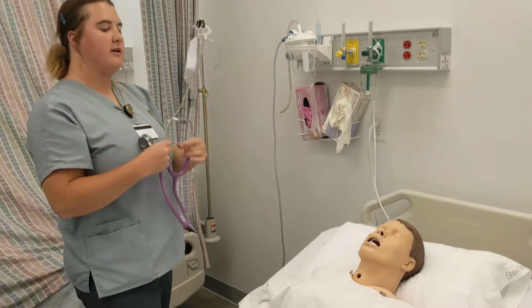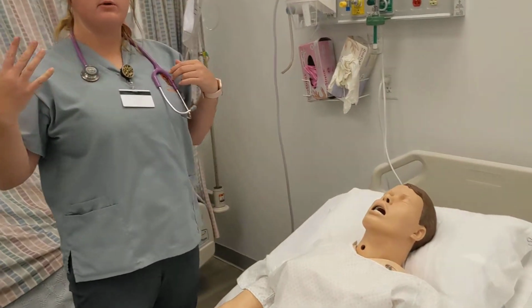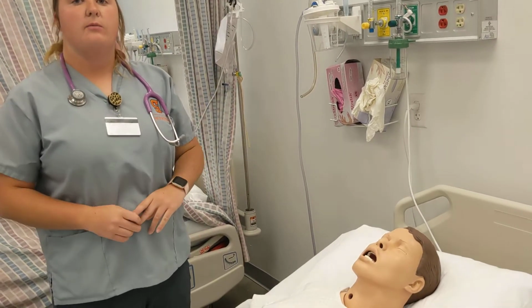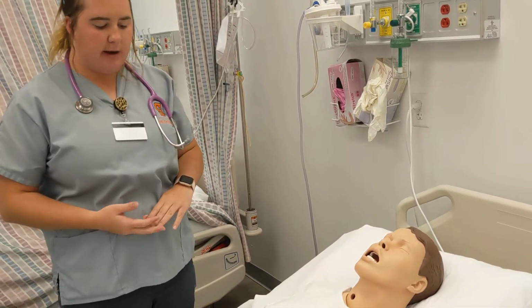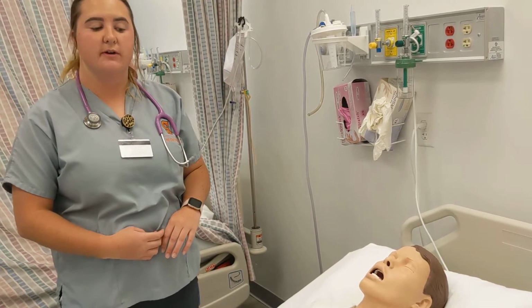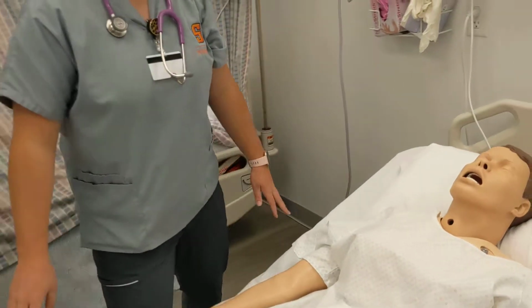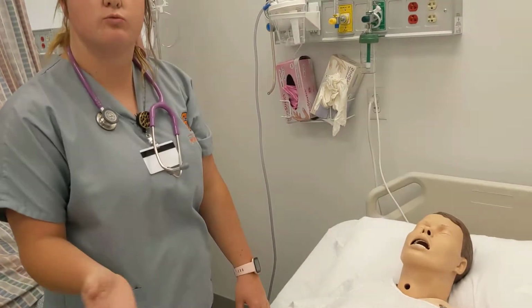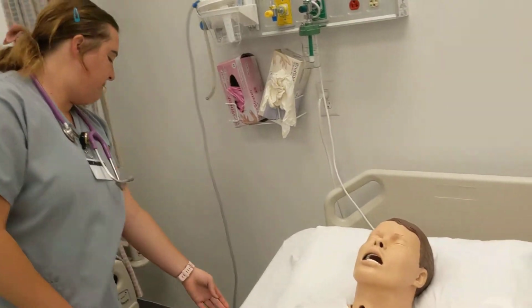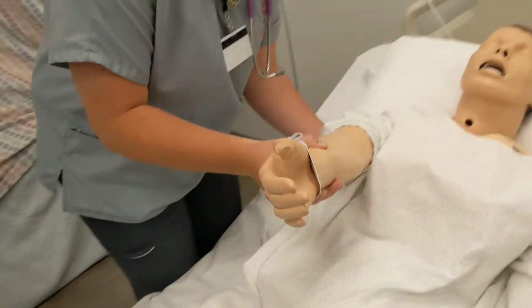All right, her breath sounds are clear. They sound really great. And now, if this was a real person, I would ask them to sit up to the side of the bed so that I could listen to their back. With our patient here that is not able to help out a lot, and we don't have extra help, and also she has surgery on her stomach right now, which is very sore, we're just gonna do the best that we can. So I'm just gonna ask her, if she can help me, to roll over that way so I'm able to see her back, and I'm just gonna listen the best that we can do today. I'm just gonna ask her to hold the side of the bed here.